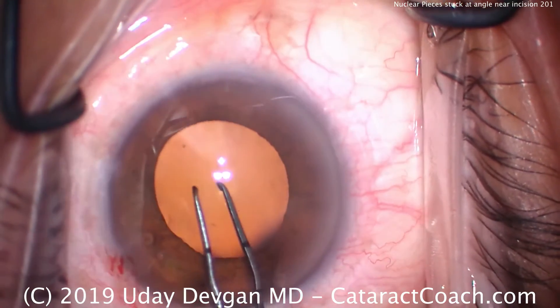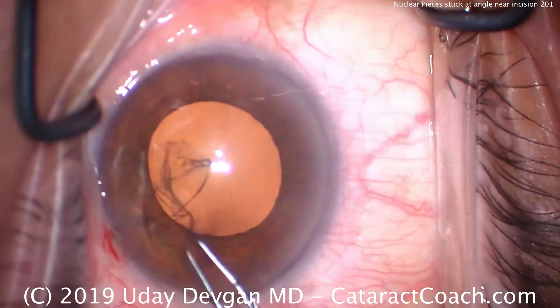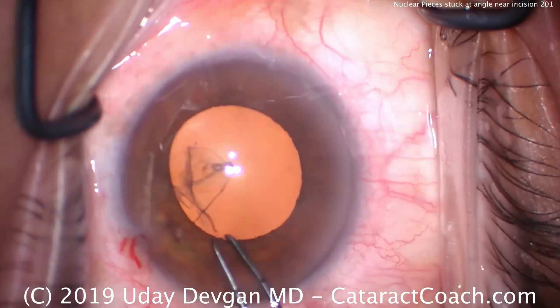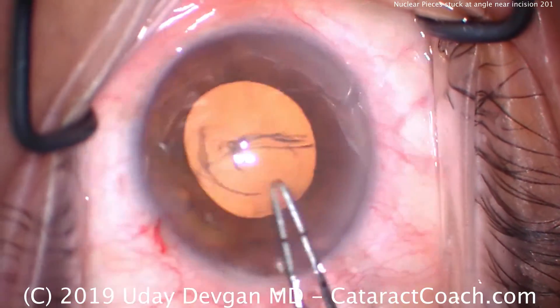Now we'll make our capsulorhexis. We can see that the pupil is probably a little bit under 5 millimeters, so we want to make this capsulorhexis large, at least 5 millimeters in diameter, making it just along the pupil margin. And that looks pretty good — we'll pivot around and finish that rhexis up.